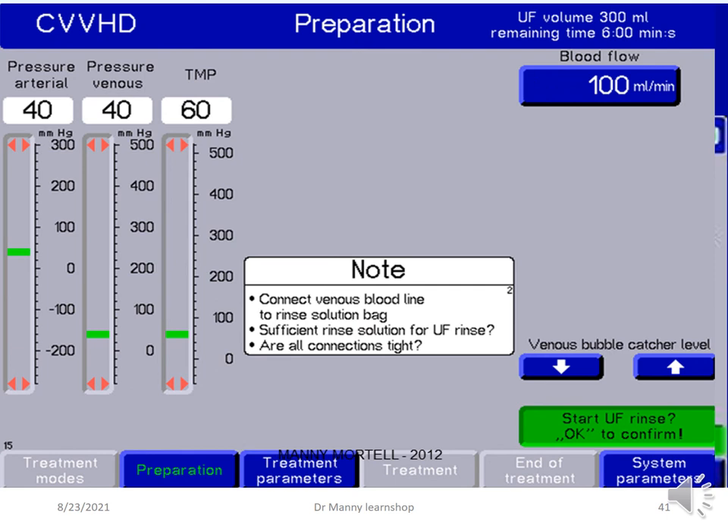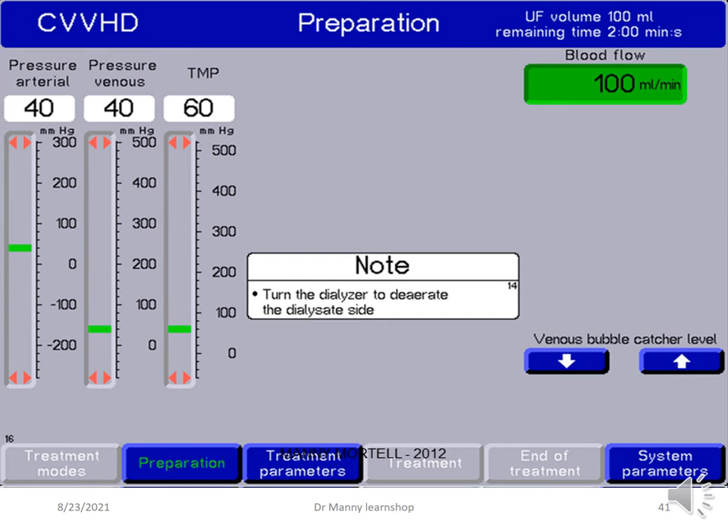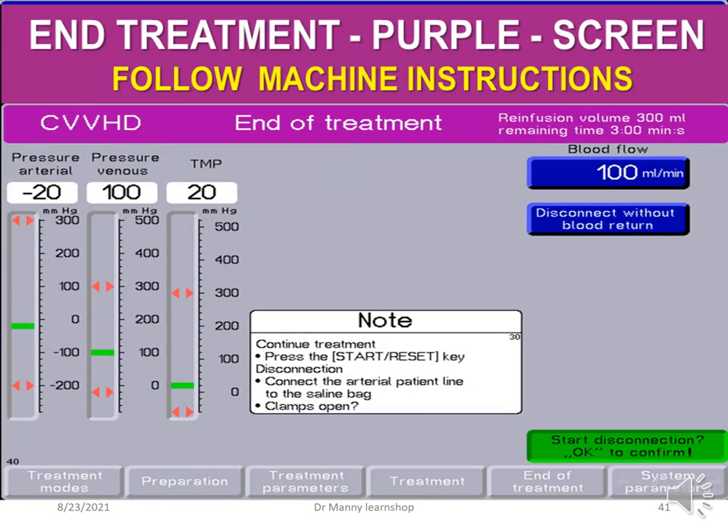The preparation screen has a blue background — in this situation CVVHD — and it gives you information, instructions, and notes on what to do. The treatment screen is green, and again you follow the machine instructions. Ending the treatment is a purple screen. The screen may ask: do you want to continue the treatment and press start/reset key, or the disconnection key? Do you want to connect the arterial patient line — not really arterial but the access line, because it's red — and are the clamps open?